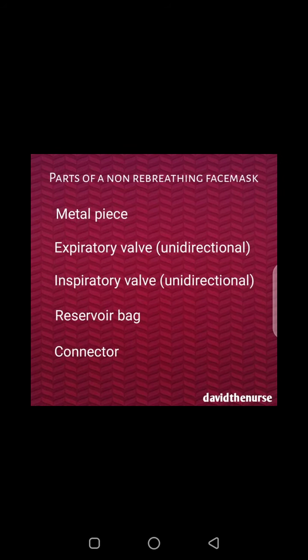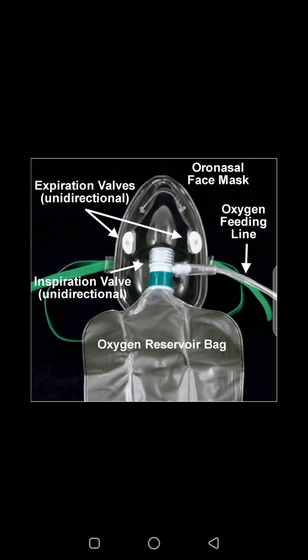These are the parts of a non-rebreathing face mask, and we shall be discussing each of them in this video. The first one I want to explain is the expiration valve, or we call it expiratory valve. The expiratory valve is a unidirectional valve, meaning that it allows the flow of air in one direction.